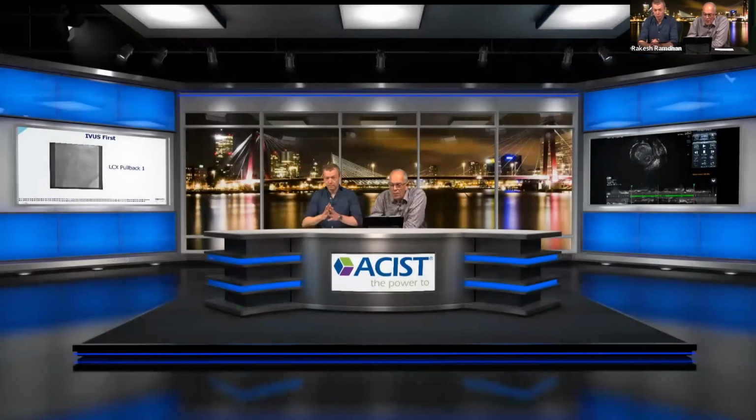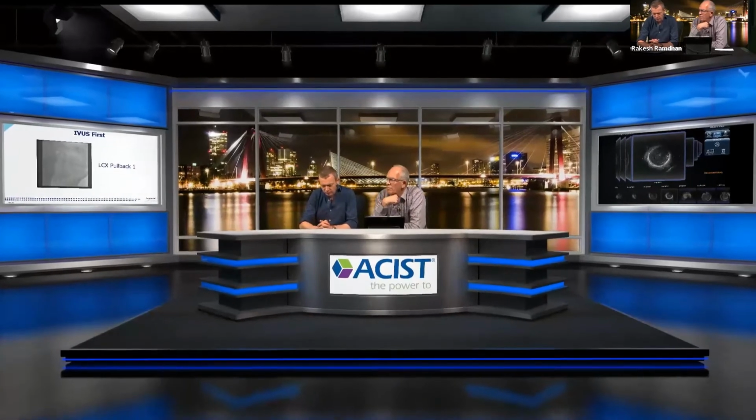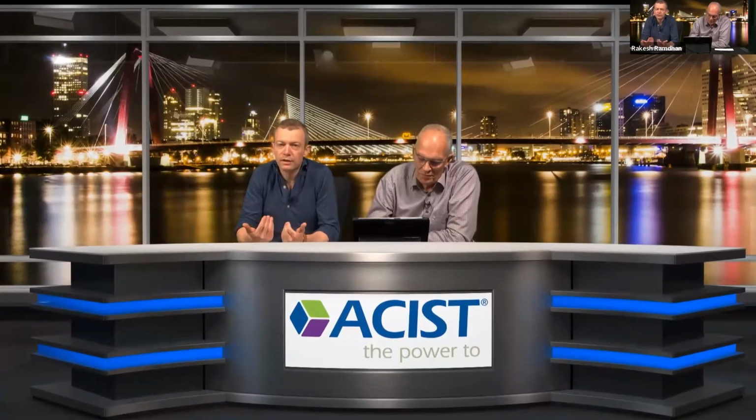Yeah. That's the good thing. There's another question: how important is identification of the plaque rupture location? I think it is very important, as you will see in cases that we present later on. Sometimes the plaque rupture is not at the spot where you think it is based on the angio alone. Plus, it will help you to identify where the lesion is, because at the end you want to stent the lesion and the stenosis and not the thrombus.